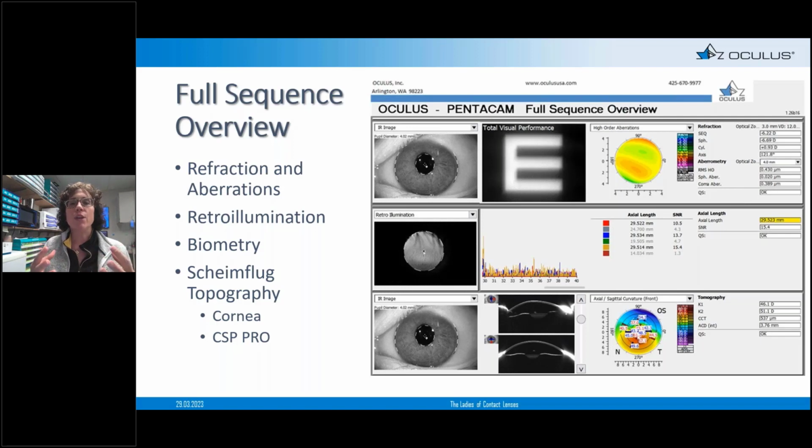Now, people with keratoconus actually have clusters of refractive points. Somebody could be a -14, but they could also be a -6. They could also be a -2 and see equally well at any of those points. So it's very important to get a lot of data on these patients, and using aberrometry data really helps you hone in on where most of the cluster of those points are. It's generally going to give you a better refraction than if you hunt for it during your regular refractive exam.